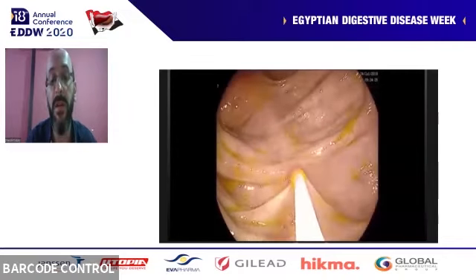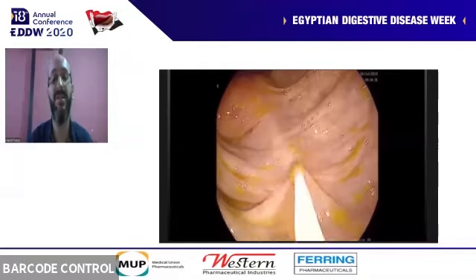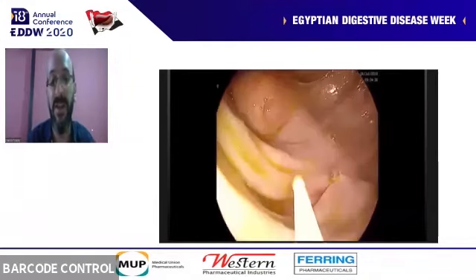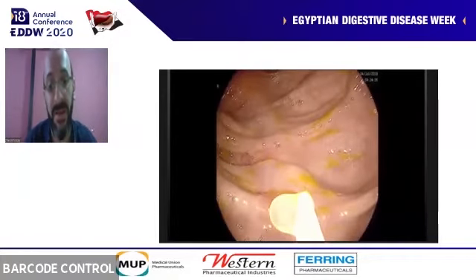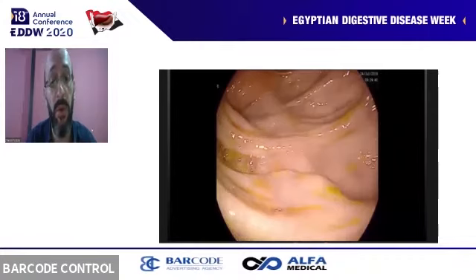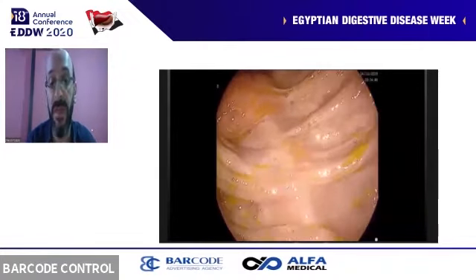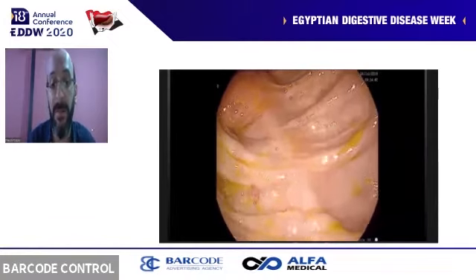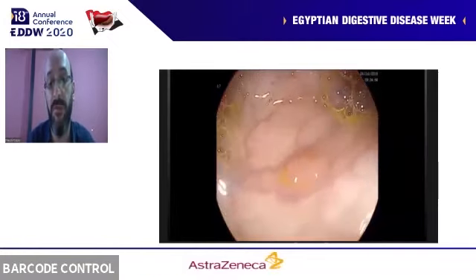Usually bleeding is not so common, and they say it's like shaving bleeding, which should be mild and self-limited, usually immediately without any assist. Sometimes with larger lesions you are doing cold polypectomy, because some now recommend doing cold piecemeal EMR, which is a little bit of a bleedy procedure. You can assess the coagulation with the tip of the snare.